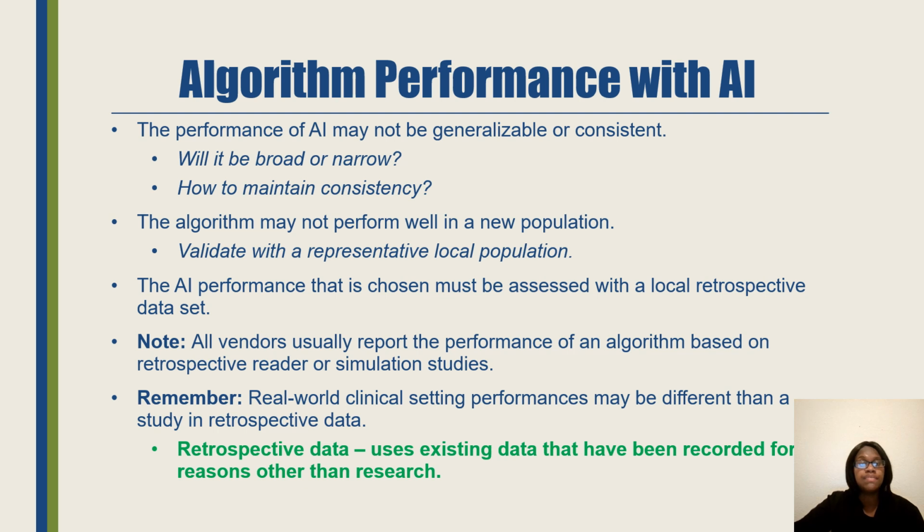You also have the algorithm performance, whether it's good or consistent with a broad or narrow, how it can maintain that consistency. Which population does it work best in? Are you testing all of the populations?